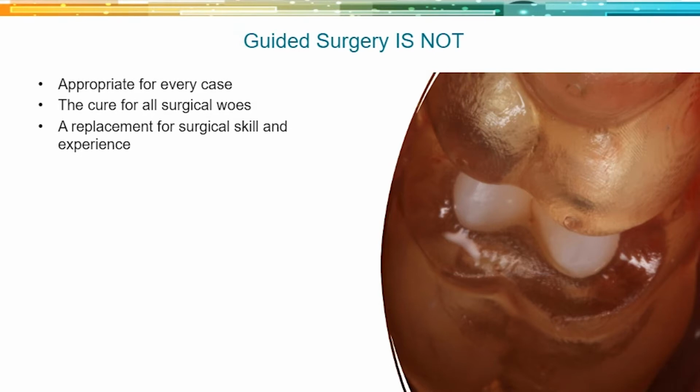So I'll tell people who are just starting to get a pilot guide for everything, because I want you to have the guide do the hard part, which is put the implant in the right spot, and then you get used to the drills and the feel of the bone and kind of how to use the kit. And then once you've done 25 of those, you can decide if you want to go fully guided or not. But it's not a replacement, so you still need to get those skills.